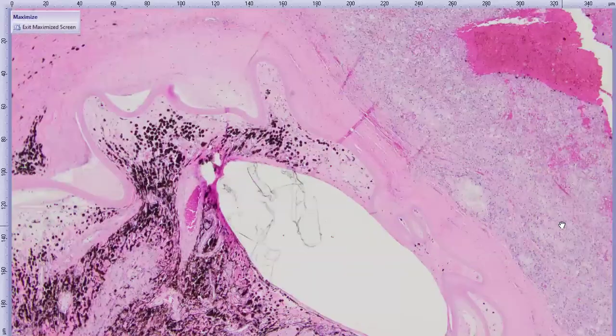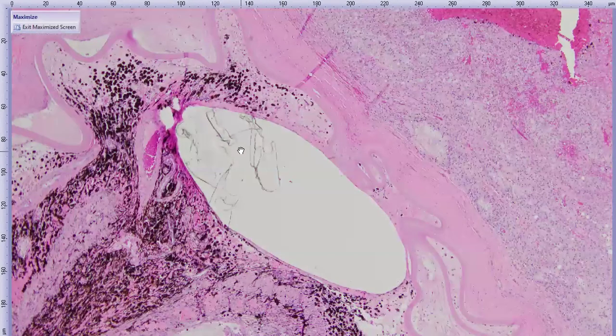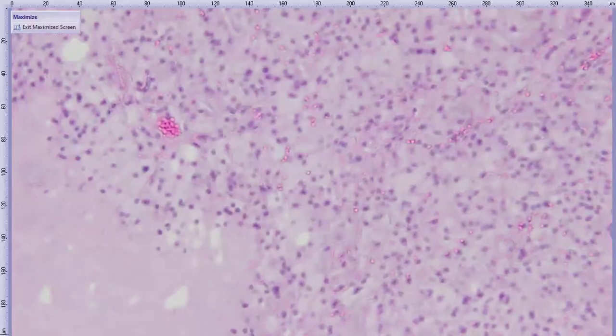And then showing that Ahmed valve right at the angle here, the dorsomedial iridocorneal angle, there is this kind of refractile material. I'm gonna run my finger here to show it. So this is that gonial valve or Ahmed valve tube as it's entering into the anterior chamber. We kind of caught that in section. All right, so let's show the cornea, what's going on here, in addition to everything else going on.